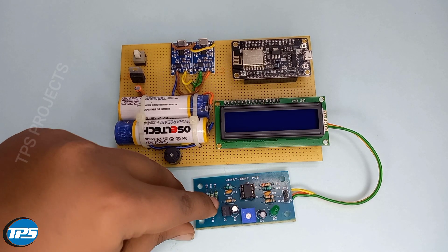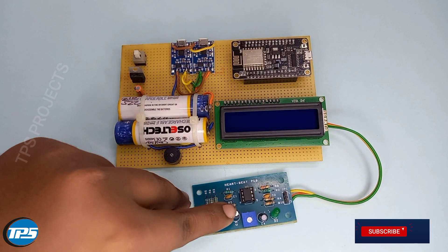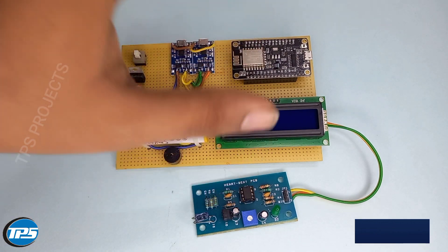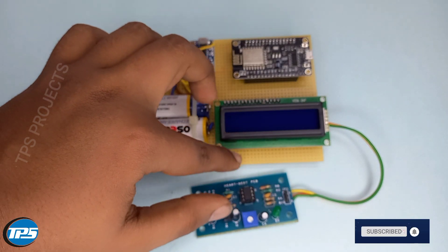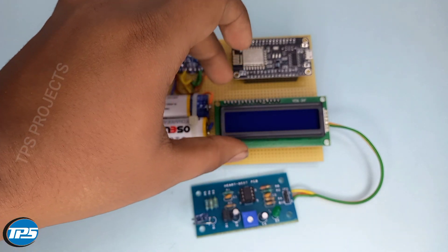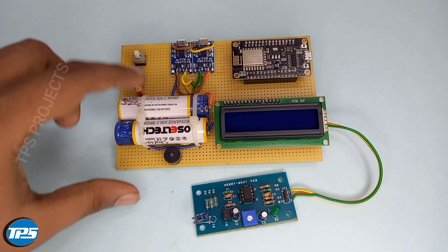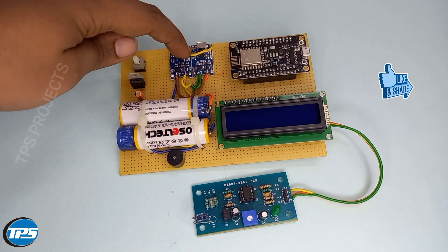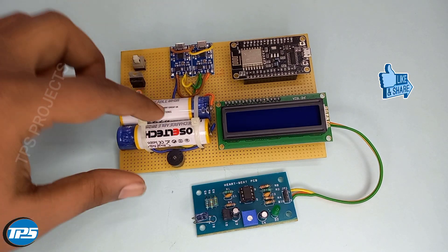Here we have a heartbeat and oxygen detecting sensor. We use NodeMCU as a microcontroller and an LCD display for a better user interface and monitoring the system. We also have a power supply unit consisting of a lithium charging battery module and a lithium-ion battery.